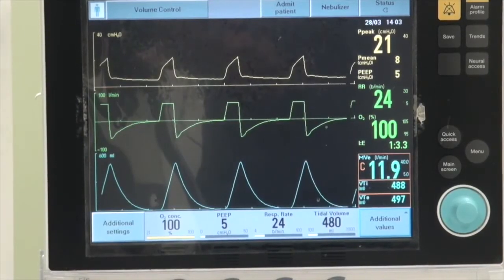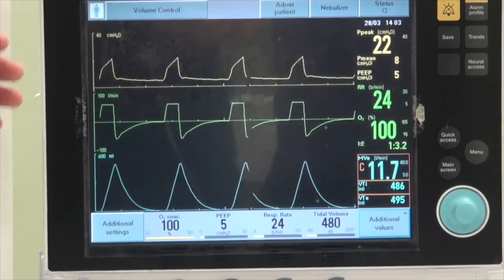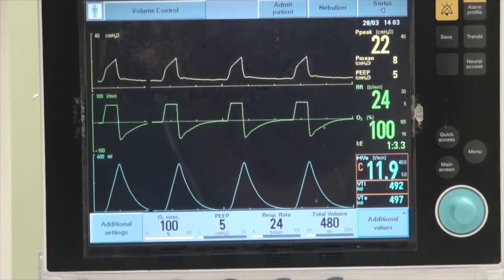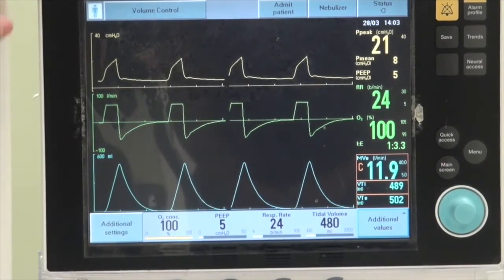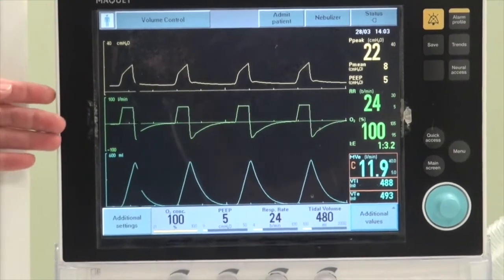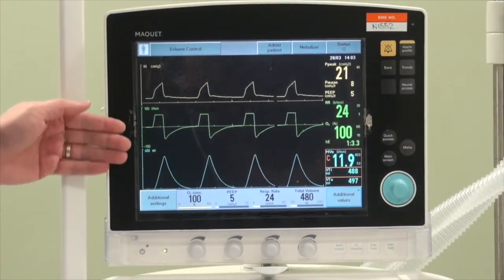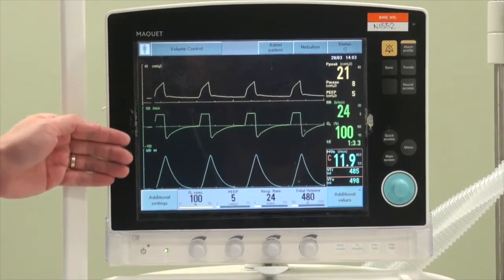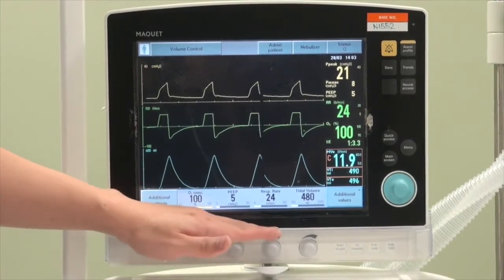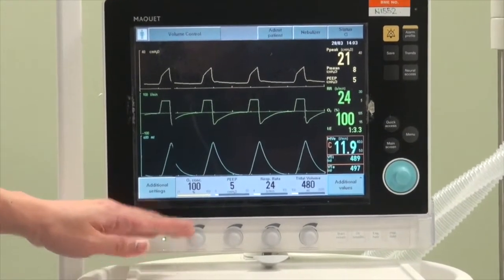The patient is now connected to the ventilator and the ventilator is delivering the required settings. The Servo-i has a touch-based screen with buttons at the side for quick access. In terms of layout, the majority of the screen displays waveforms, which allows us to review and look for any features of dyssynchrony. At the bottom, you have access to quick settings where you can make adjustments without going into the main menu.